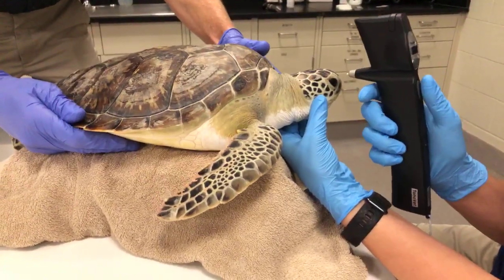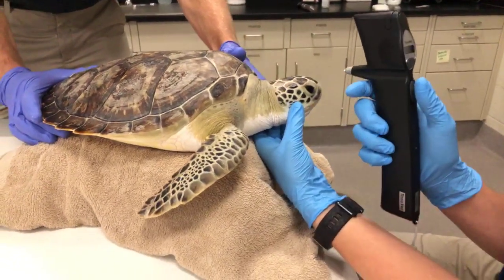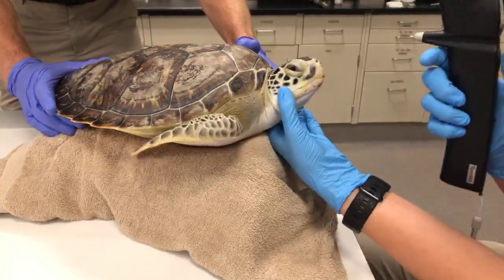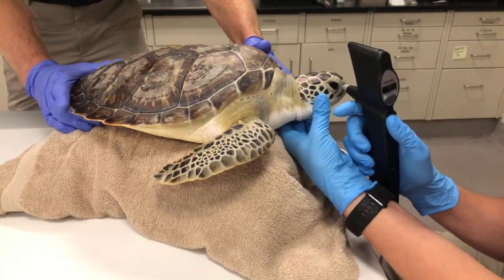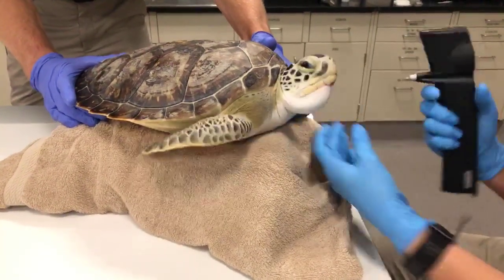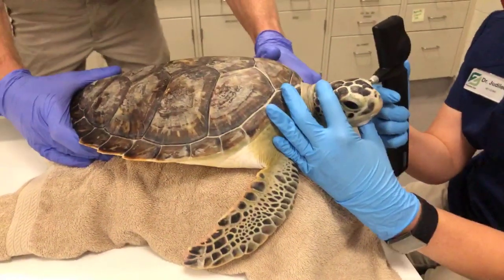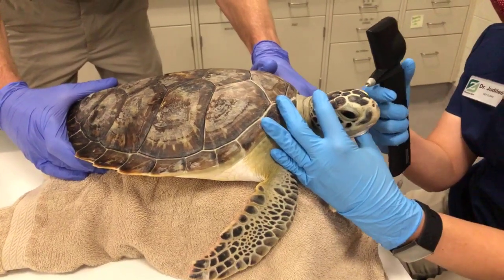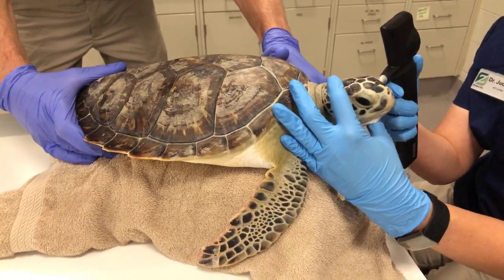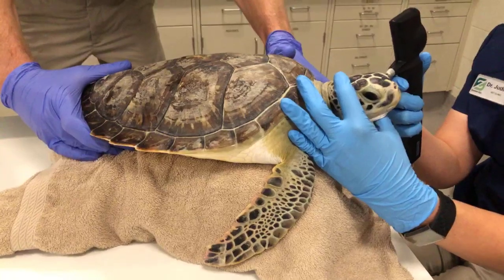This is the same type of device that's used on people to measure, and what we're looking for is something like glaucoma. If it's too high, it would be glaucoma. What would that mean for the turtle if it was found to have glaucoma? I have never heard of glaucoma in a turtle, but it could alter its ability to see. It could make it blind, and if it is a condition that can't be medically cured, then it would probably be unlikely to survive in the wild. If we find it, we will certainly look for therapy.